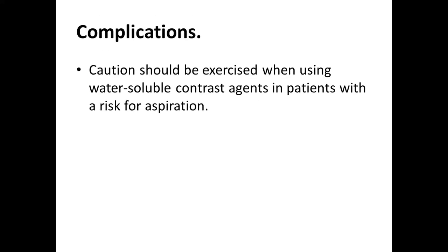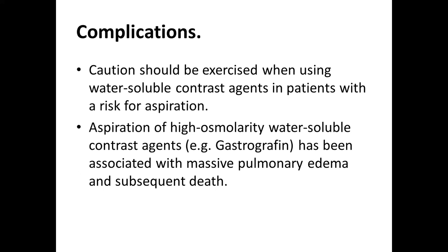So we have to do these studies with caution because of the harmful effects that can come as a result of aspiration. So caution should be exercised when using water-soluble contrast agents in patients at risk of aspiration, as I've already mentioned.